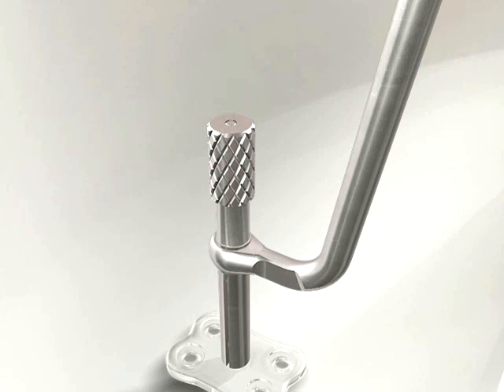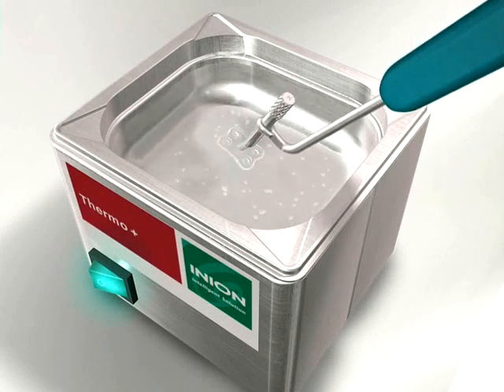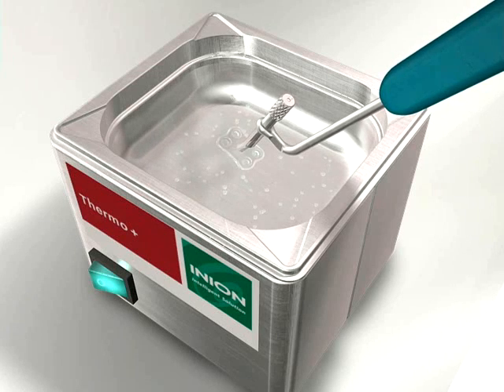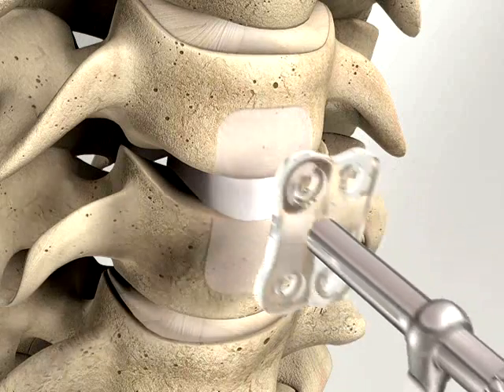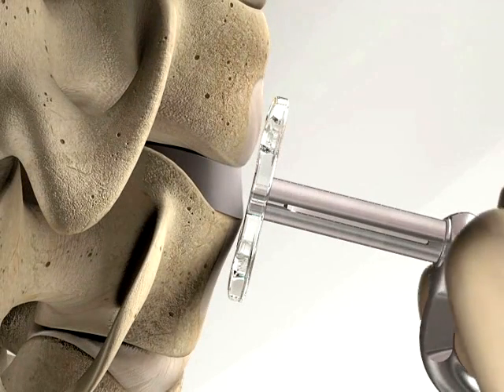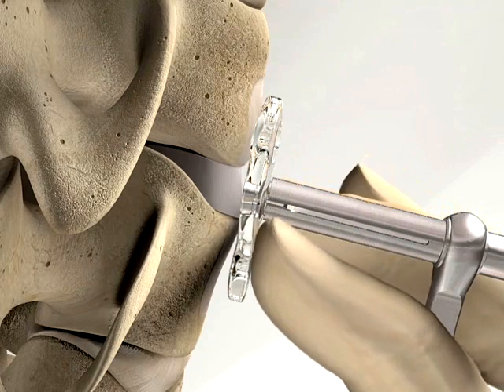The plate can be easily contoured using the water bath treatment with the plate attached to the plate holder. Place the plate in the Thermo Plus water bath for approximately one minute. Thereafter, the plate can be shaped against the pre-shaped template by pressing the warm plate firmly against it. The plate can also be formed by pressing it directly on the bone to conform to the anatomy. The plate should cool off and become stiff within 10 seconds.